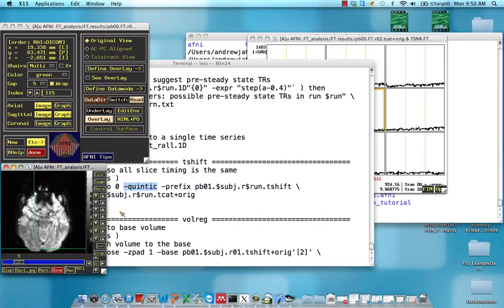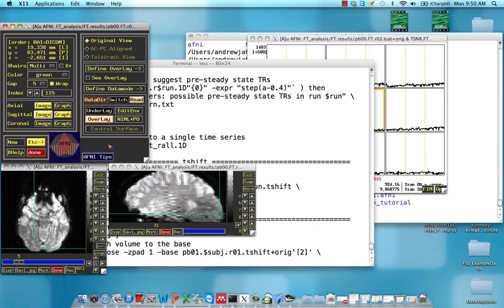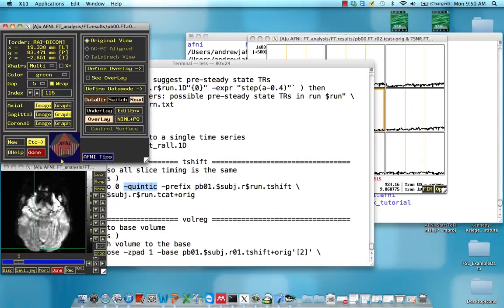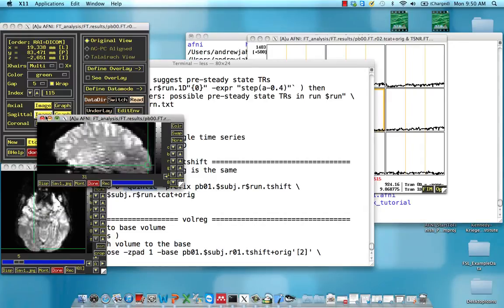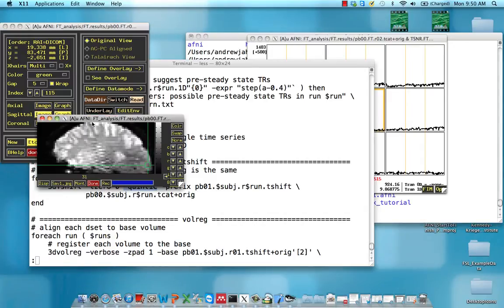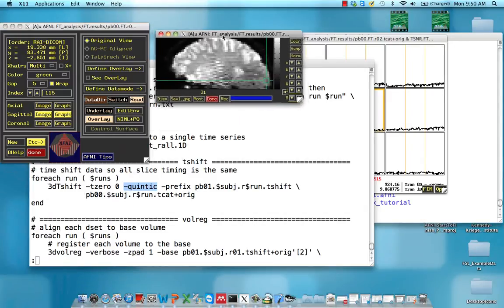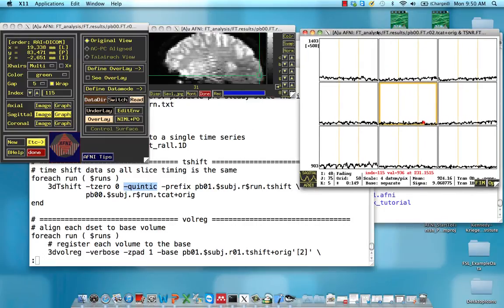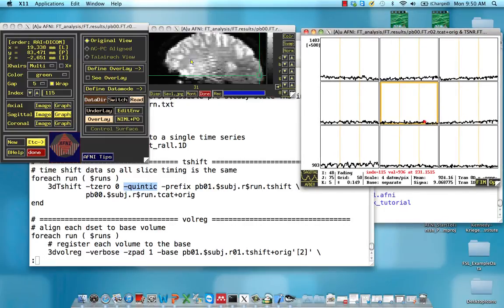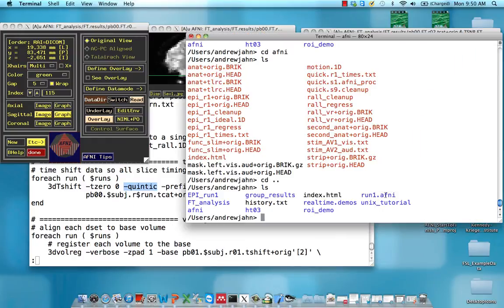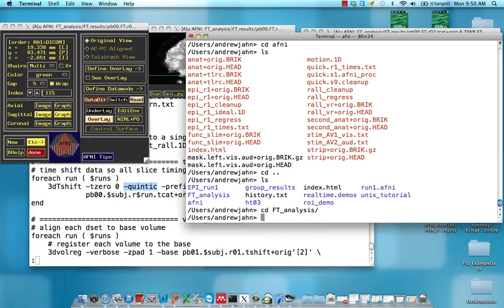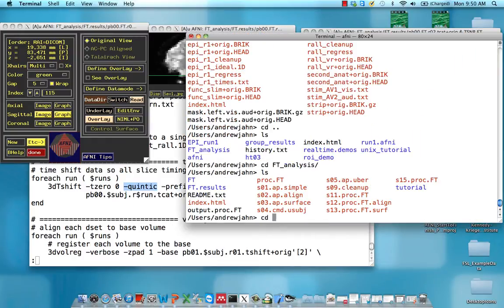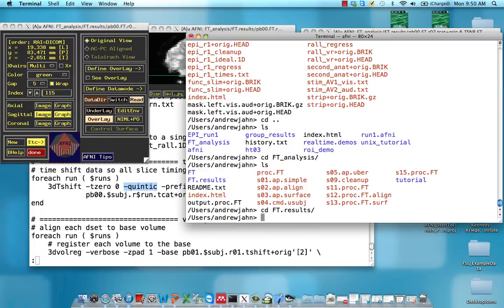So I'll show you what this looks like. I'm going to close that image, just leave the sagittal image open. And what I'm also going to do is go to ft.analysis, ft.results.